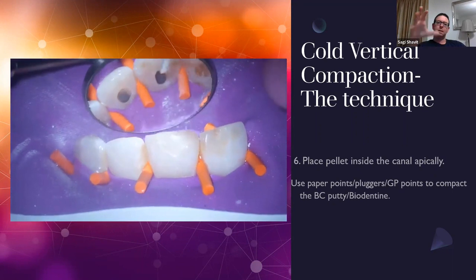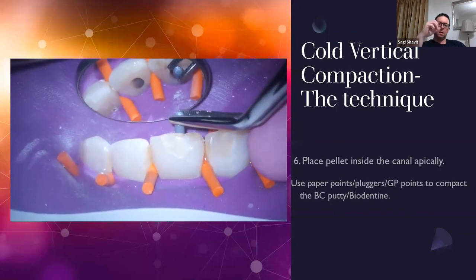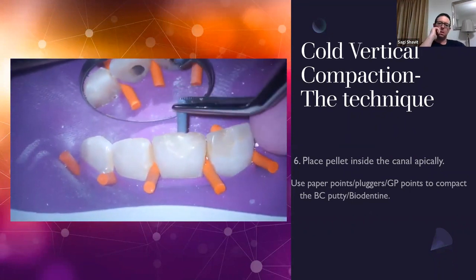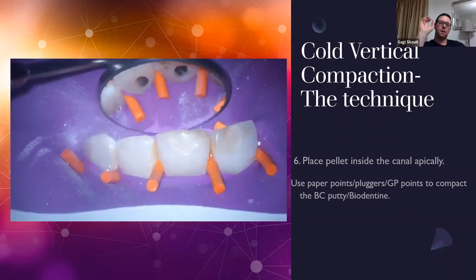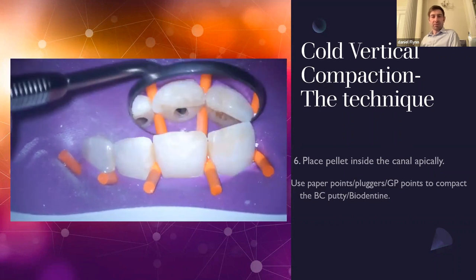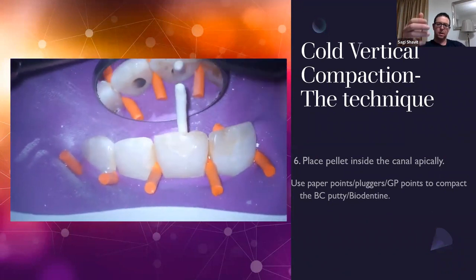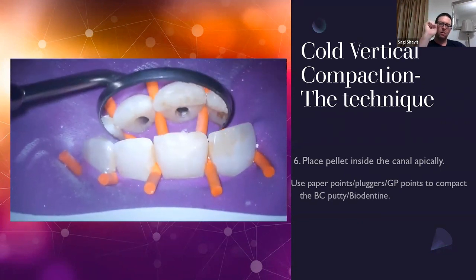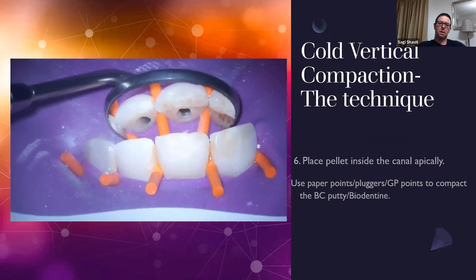You see, I take the GP point, put it in an apical direction, and that's it. The pellet is gone. It's at the apex, okay? It's nowhere else. It can only be at the apex. Yeah, I mean, that's so nice and clean, isn't it? It's so quick. That's another advantage of, now I'm using a size 100 paper point. And you see, I'm lightly tapping, not violently, not pressing, no, lightly tapping, tuck, tuck, tuck, like that, okay?